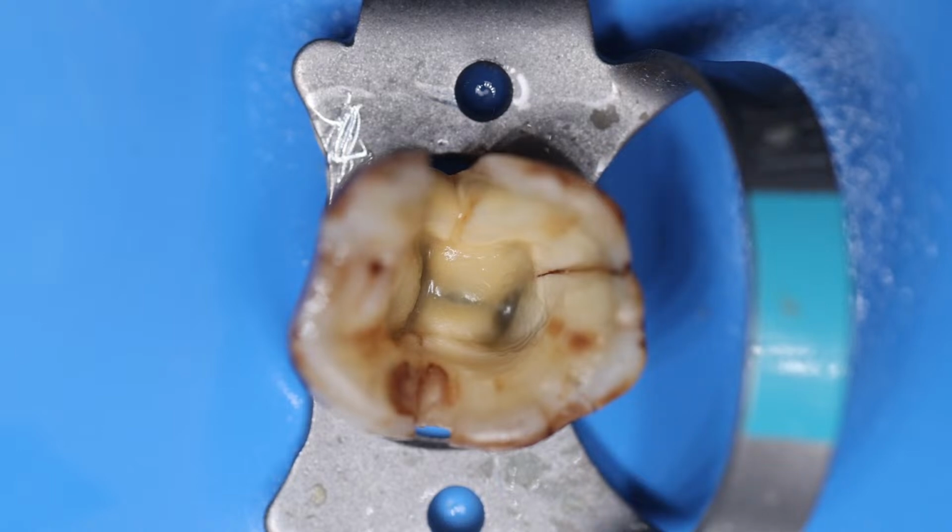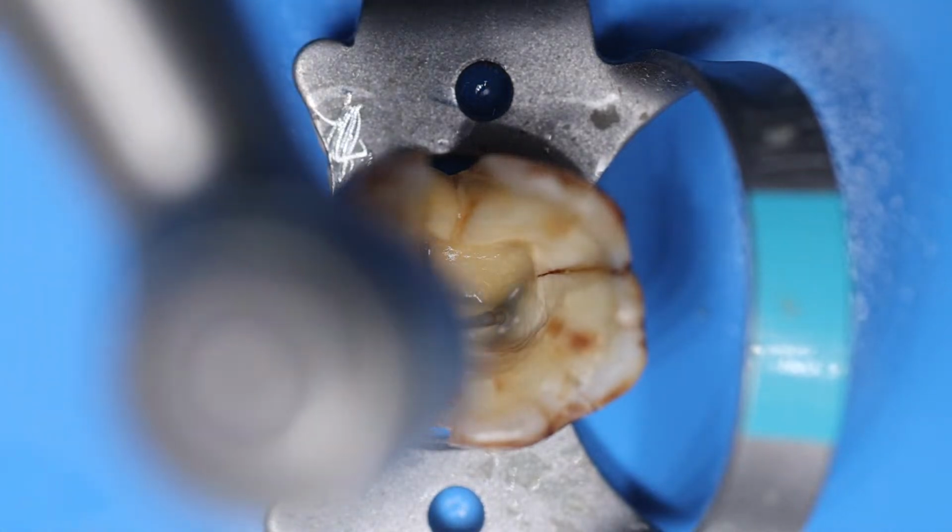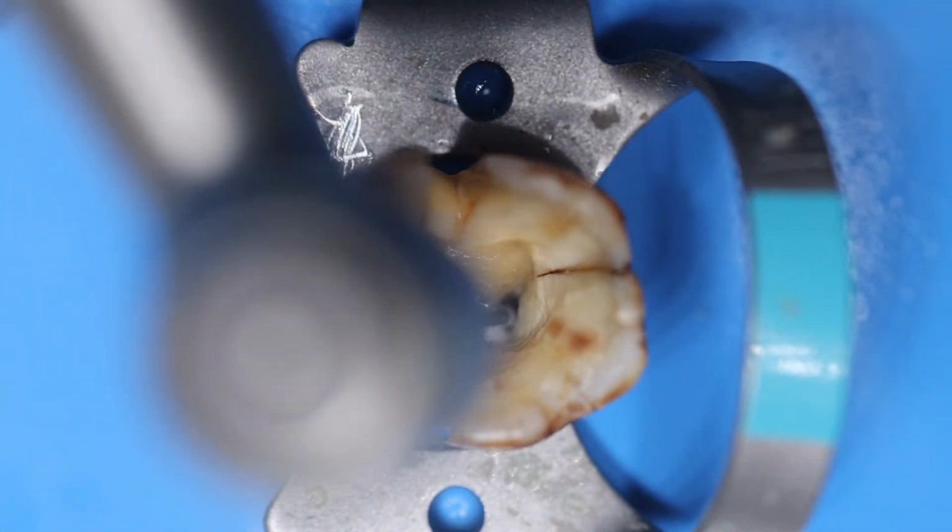I am just showing you the demonstration of how we can use the GG drills. Now we are just into the orifices, and we are using the GG drill. This is size 1 GG drill to enlarge the canal orifices.